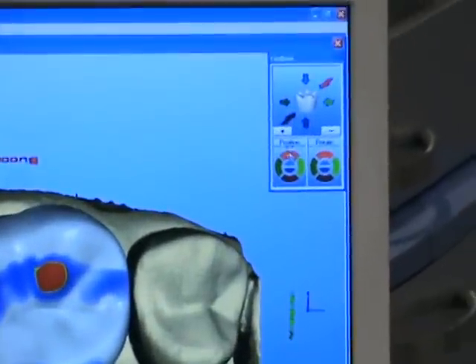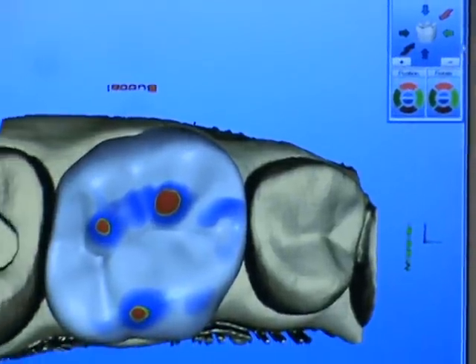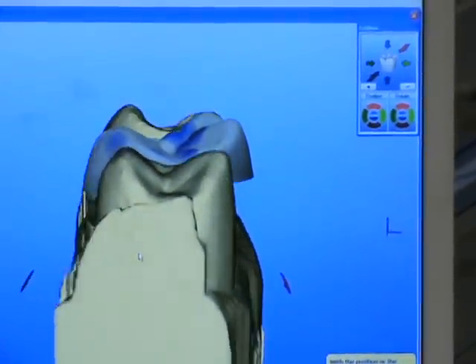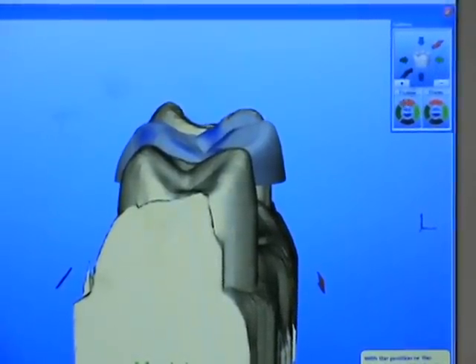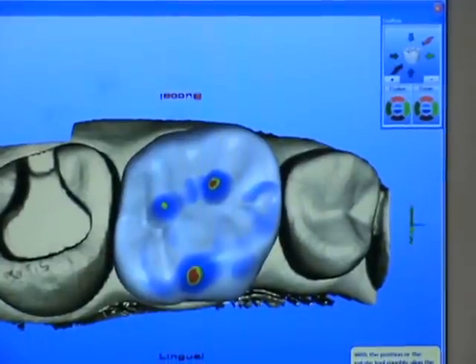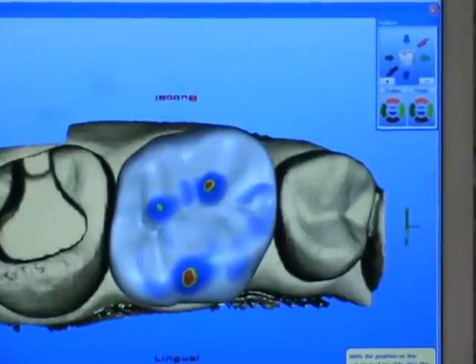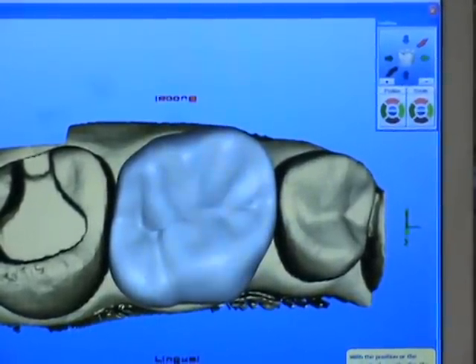Position it slightly to the buccal to line it up better in the arch. I can take different views to make sure that it lines up well. Once satisfied with the overall position of the crown, I click my green arrow button and proceed to the next step.